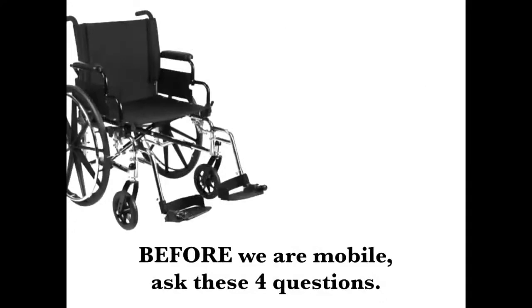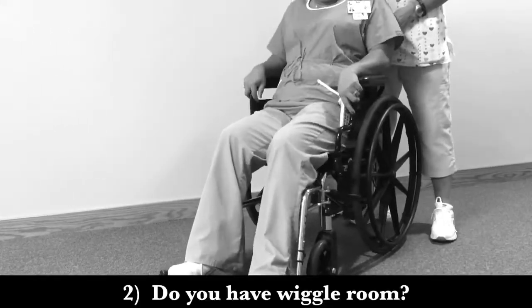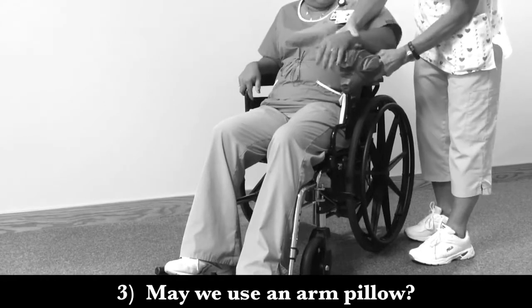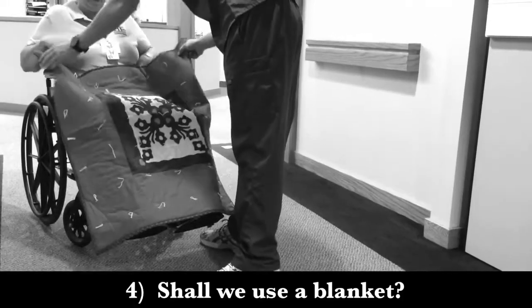Before we are mobile, ask these four questions. Are your paws on the foot pedals? Do you have wiggle room? May we use an arm pillow? Shall we use a blanket?